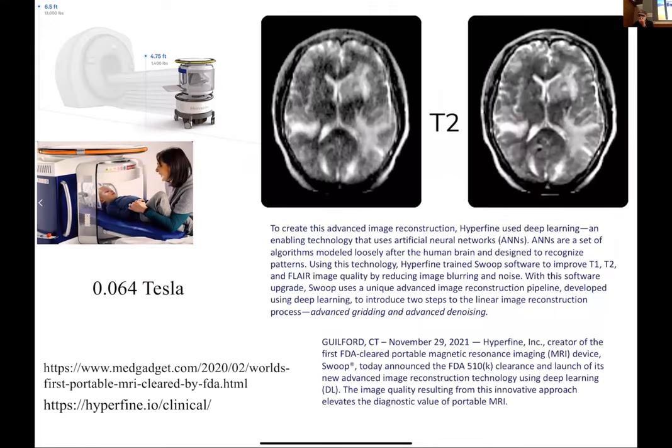The other one that's gotten a lot of press these days is a different approach, which is saying, well, for a lot of MRI, you don't necessarily need the best looking image. You just need something good enough to see if something's wrong, right? This is along the trends of what's called POC, or point of care. The business model here is, if it's cheap enough, we have one of these at every CVS or Walgreens, right? You just walk into your Walgreens and get an MRI done, right?